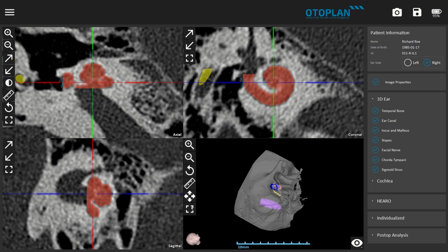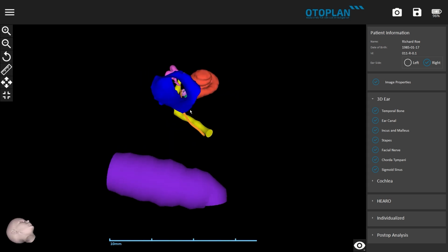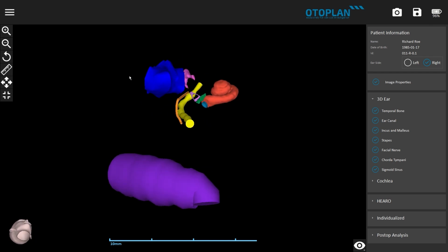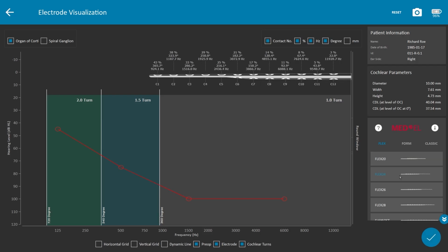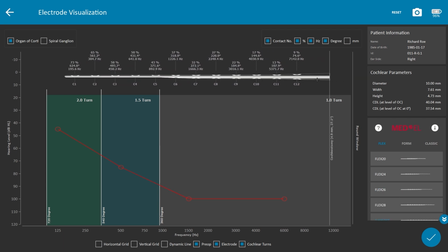So within the cochlear implant workflow, and I know you mentioned preoperative and postoperative, where does the OTOPLAN actually fit? Yeah, so preoperatively, really the surgeon, or the audiologist, depending on the center, is getting that information prior to selecting the electrode array for that patient. Sometimes patients have not already chosen which device they're going to get. So we have a lot of centers that want this information so they can make an educated decision using that objective anatomical information.